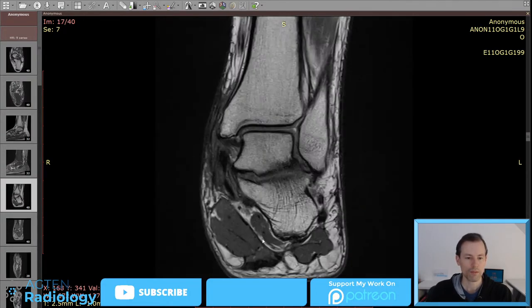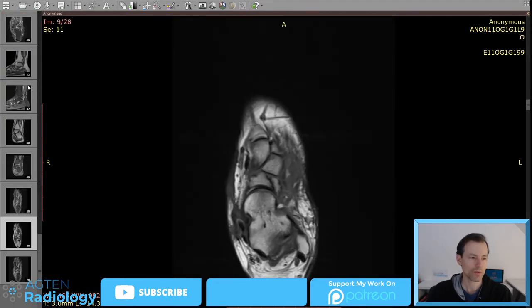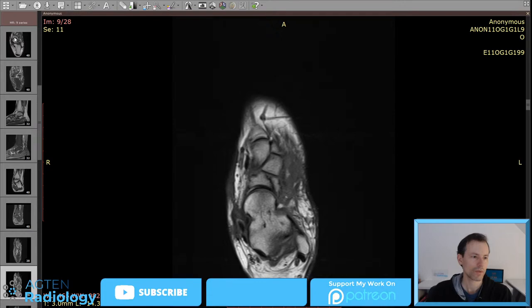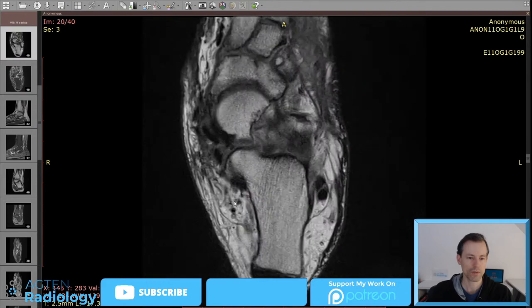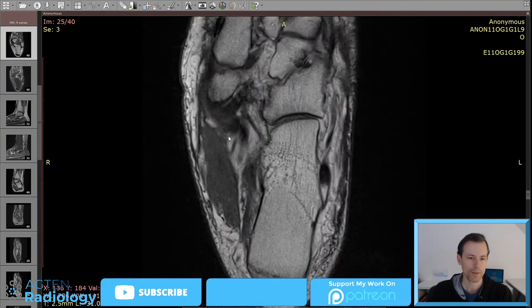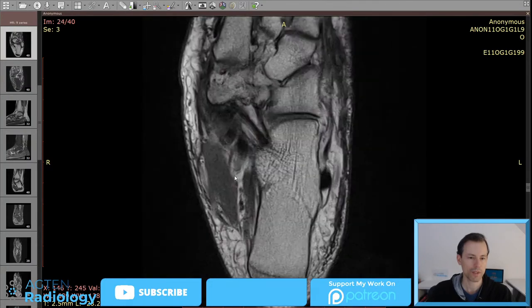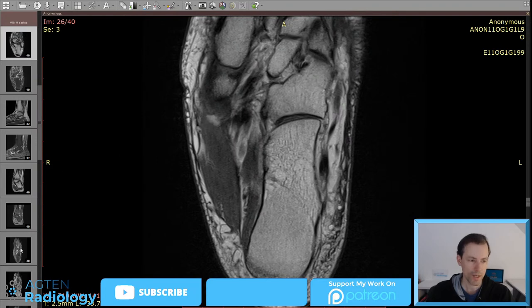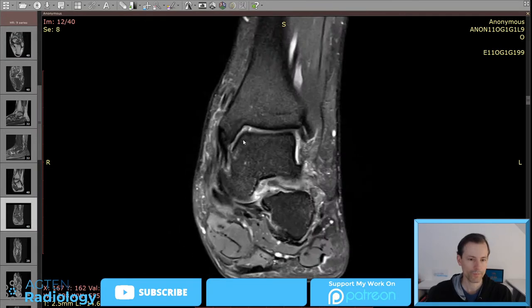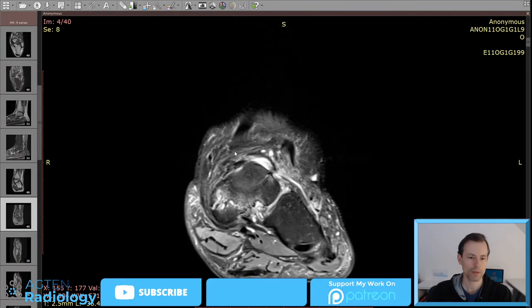And if you see something like this, we should check the nerves, right? So we go check the nerves. And where can we check the nerves? Maybe on this one. The tibial nerve and its two branches, the medial and lateral plantar nerve. It's not well visualized here. We can hardly appreciate it. It could be technical, but maybe it's just the image quality here, which is a little bit hazy. But if we go, I think, on this one, and we are now on the posterior aspect, we have the tibial nerve coming down.